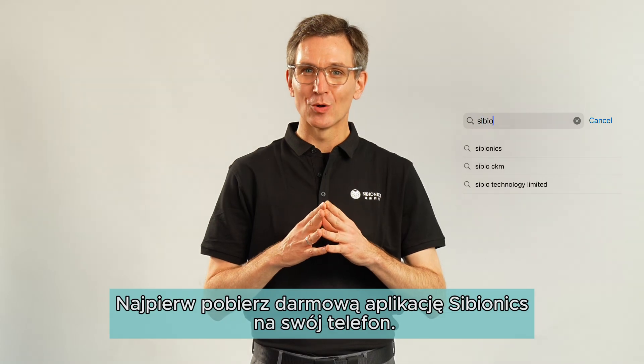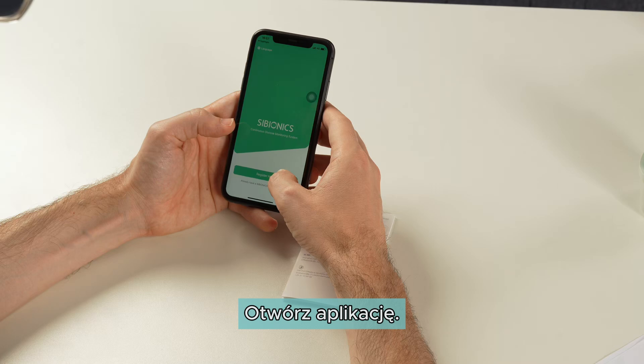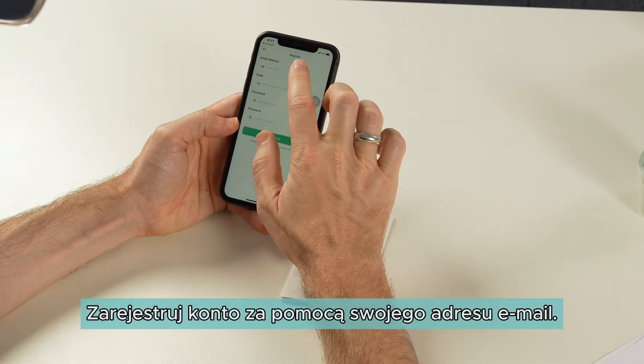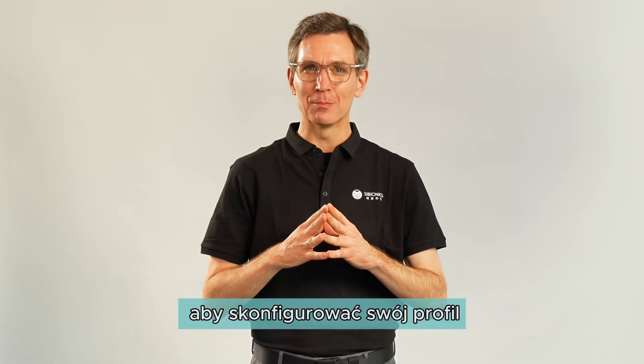First, download the free Sibionics app to your phone. Open the Sibionics app, register an account with your email address, then follow the in-app instructions to set up your profile and preferences.